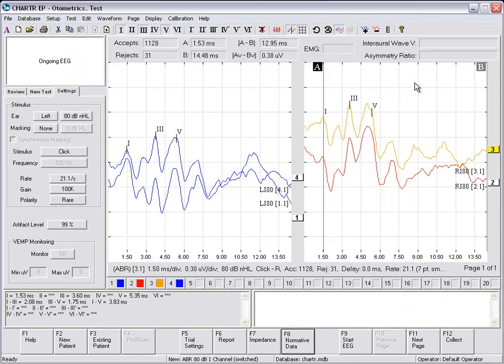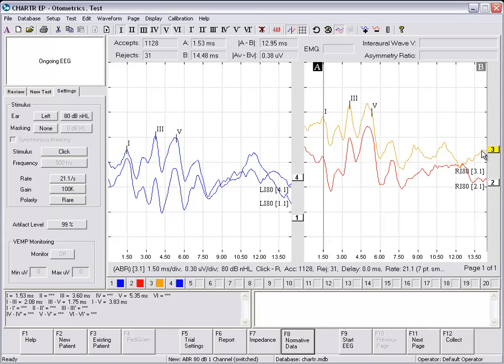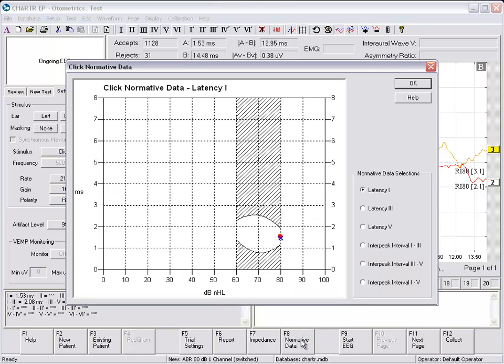If you select two waveforms, you'll see that 3 is highlighted here. And if you select Control and click on number 4 and then select Normative Data, you'll see both waveforms are shown here for Wave 1.